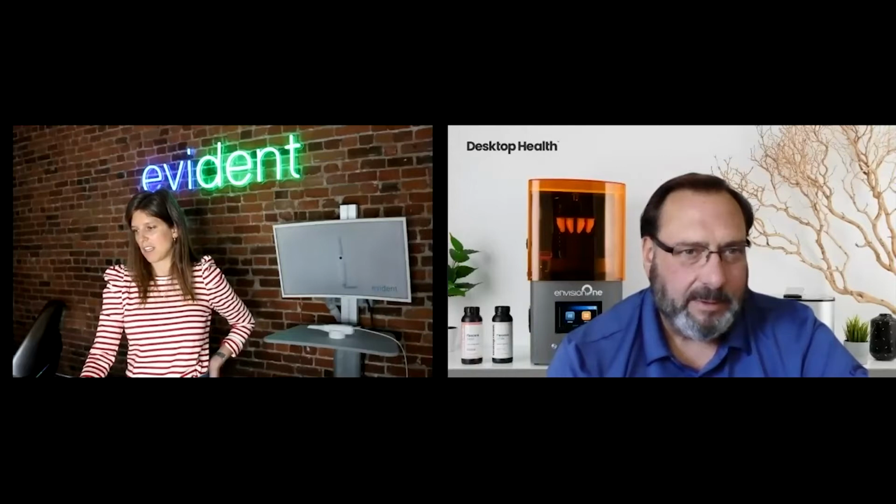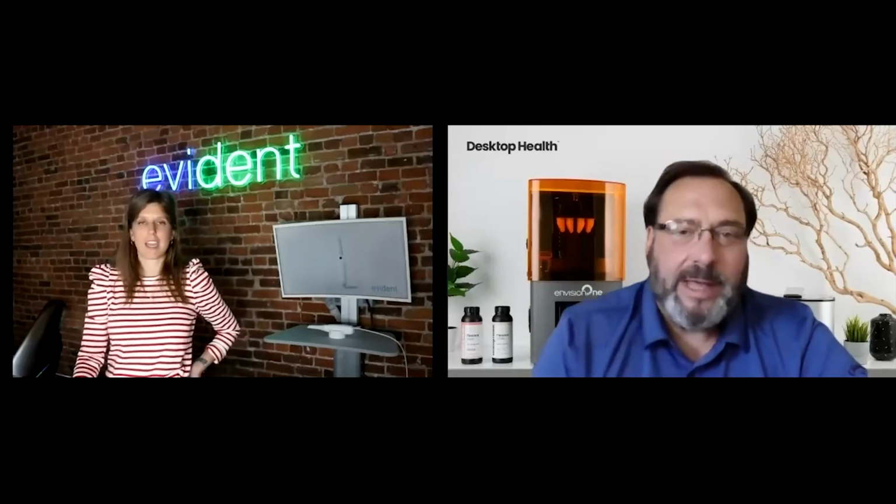So basically, how do you articulate the arches to make sure it's set up properly? Again, that's all done in the software, and also in the scanning software as well. In terms of making sure that you're trained properly on how to use the scanner, how to scan an edentulous patient, how to take the bite with an edentulous patient, that is a really good thing to talk to your scanner reseller about. So that's where it comes back to training and support. Anything around capturing the bite or digitizing that impression is all scanning.